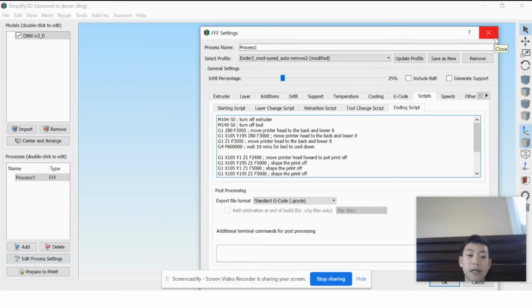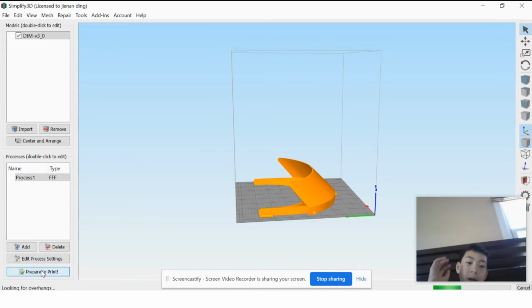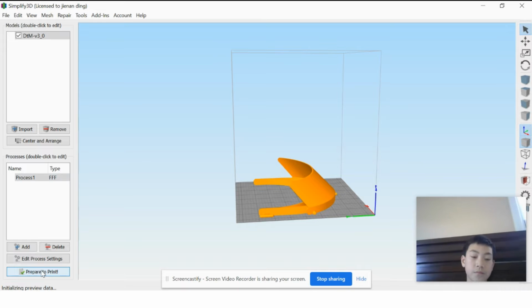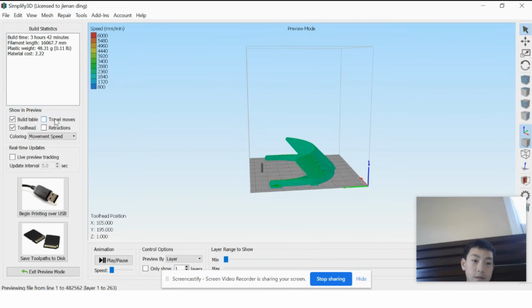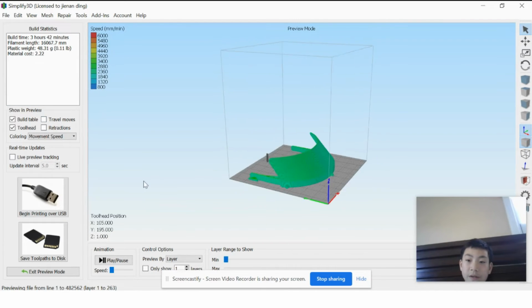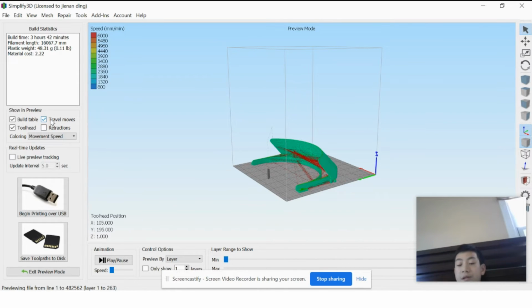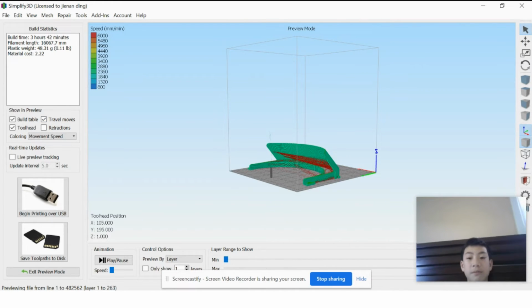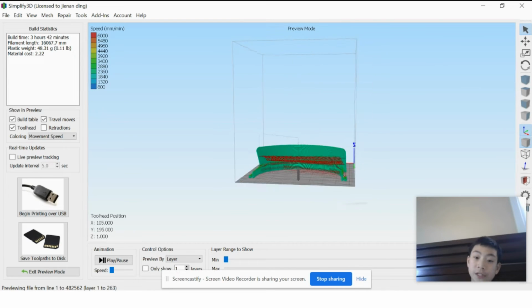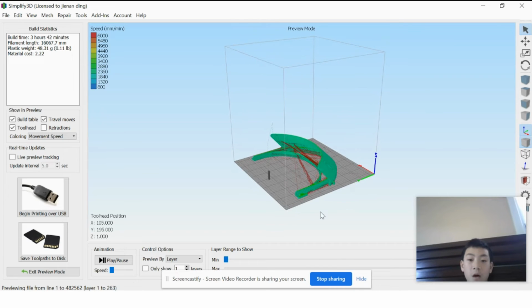Once you've done your process settings, you're going to leave process settings and go into prepare to print. It might take a while. In prepare to print, you'll see your print and the time, but you want to turn on travel moves so you can see where the nozzle goes. Usually, you should probably do this before you actually write the G-code so you can see where it ends and make it move along wherever you want.